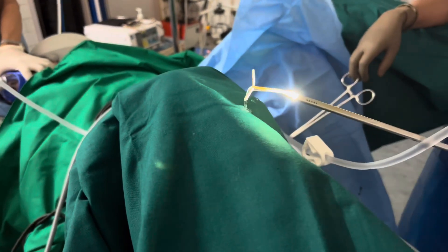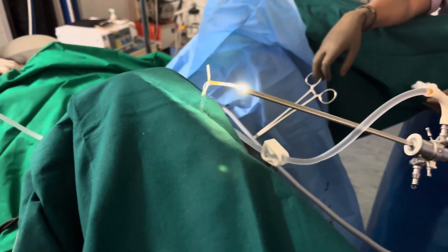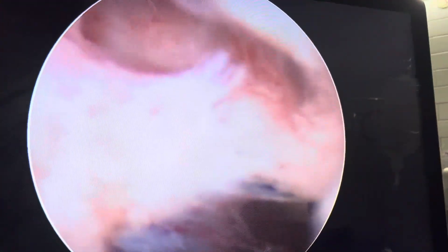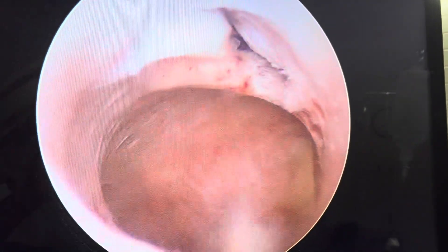As you can see here, the copper T is out. I then introduce the hysteroscope to check why she had spotting per vaginum. The cavity looks okay, the ostia are okay — it looks more like an atrophic endometrium, and there is no other reason for the postmenopausal spotting.